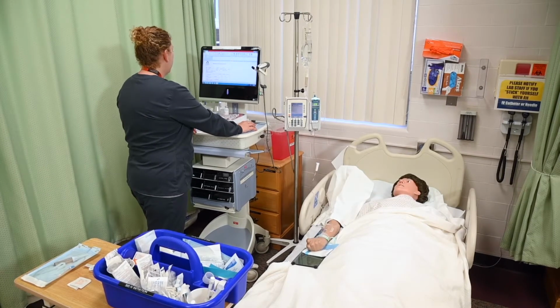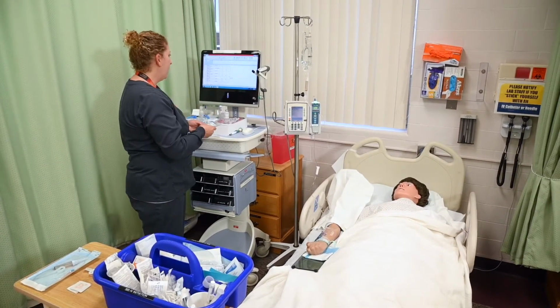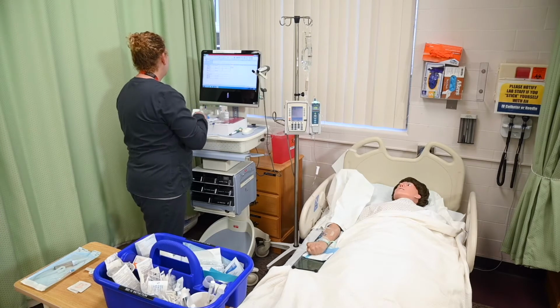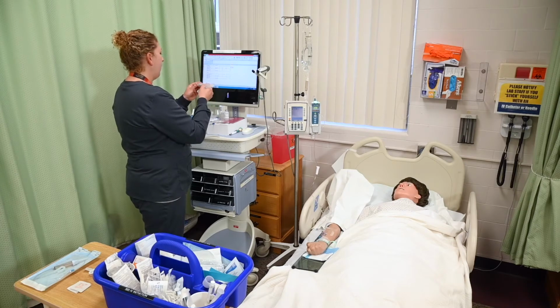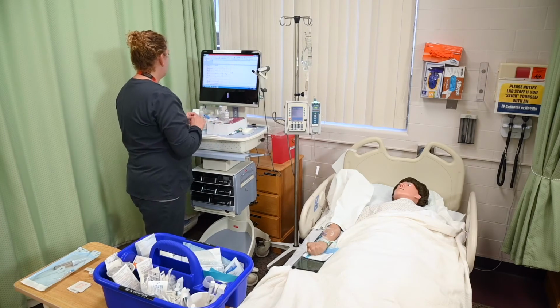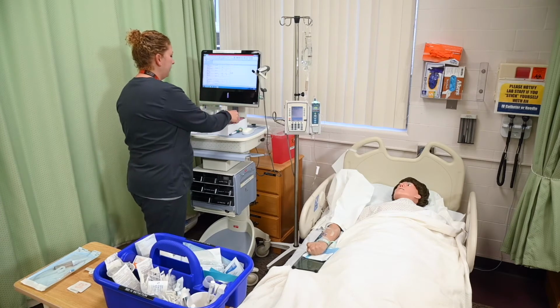IV practice, date of birth 3/3/87. Ceftriaxone 1 gram, IV piggyback daily. The time is now. I have ceftriaxone 1 gram and 0.9 sodium chloride 50 mLs for IV practice. Date of birth 3/3/87. 0.9 sodium chloride 10 ml IV push PRN flush. I have 0.9 sodium chloride flush syringe. IV practice, date of birth 3/3/87. 0.9 sodium chloride 10 ml IV push PRN flush. I have normal saline IV flush 10 mLs.